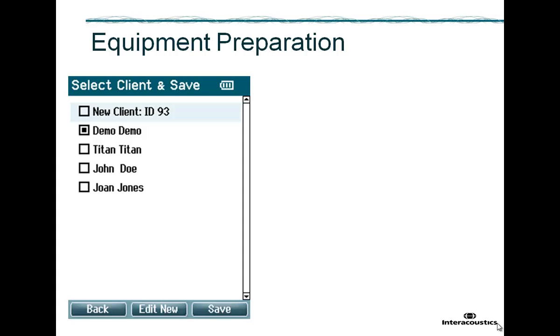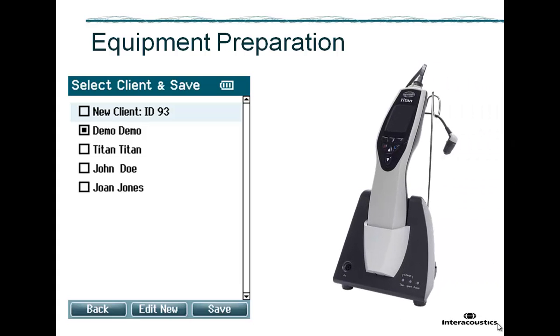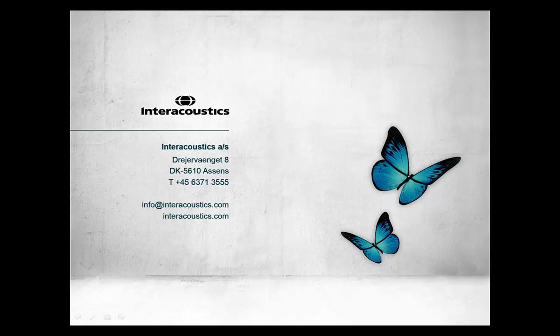If you wish to switch off Titan, hold down the R and L keys together for about one second. Once finished with the device, place it back in the cradle to recharge the battery. This concludes this quick guide video on handling Titan for neonatal screening.